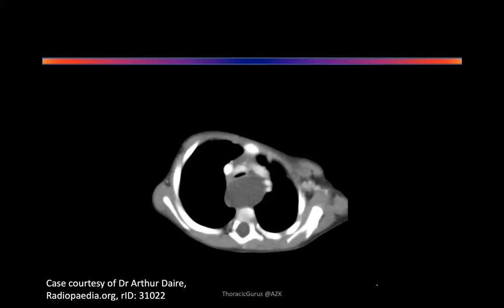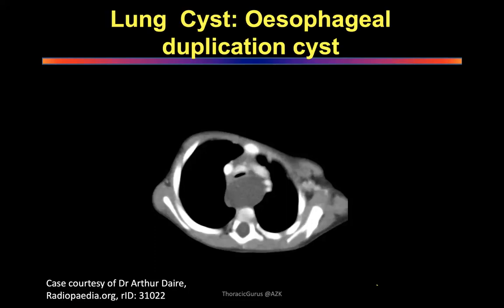All right. So bronchogenic can happen in the posterior mediastinum. Bronchogenic can be anywhere in the body. That's the problem. My first diagnosis would be esophageal duplication cyst. My second diagnosis would be bronchogenic cyst. As simple as that. That is how the exam is held. It is very simple. It is not complex. Don't over-diagnose things.